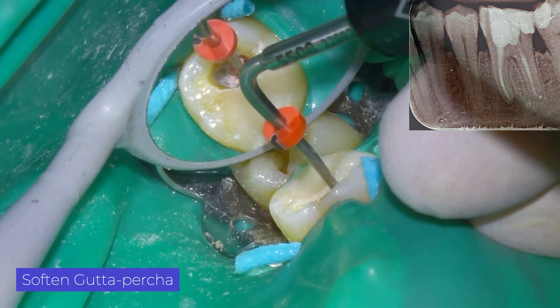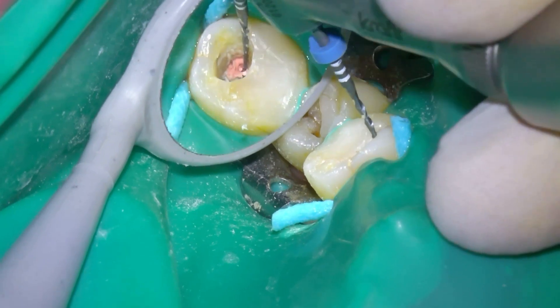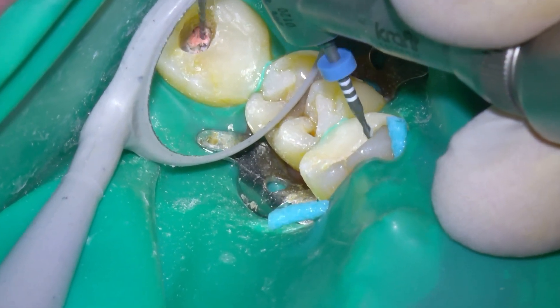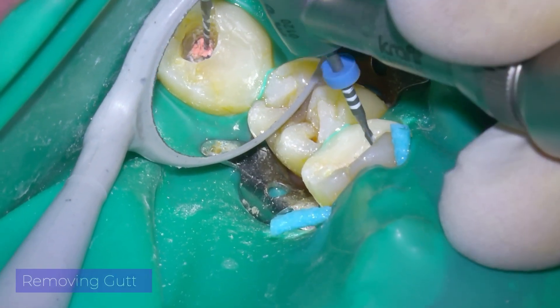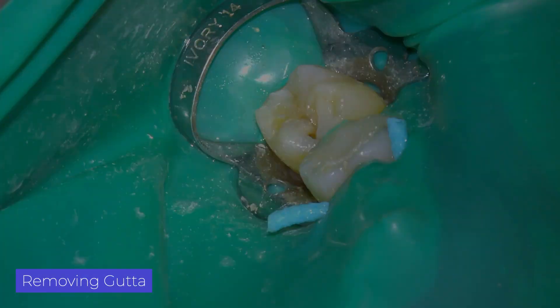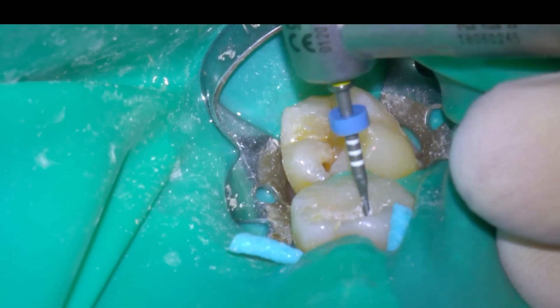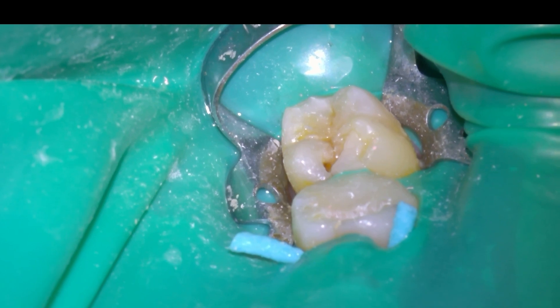Once I make the opening, I find the MB root canal. The first thing I usually do to remove gutta-percha is soften it with heat. Then I use rotary files, with the intention of using them up to two-thirds of the root. Then we will use manual files when we are close to the apical foramen.